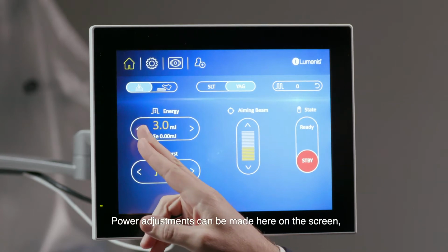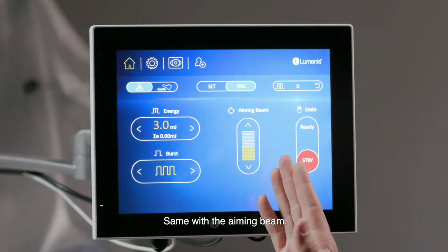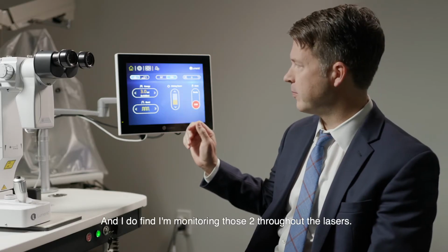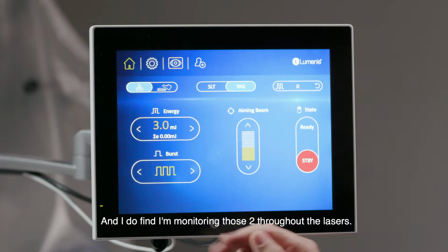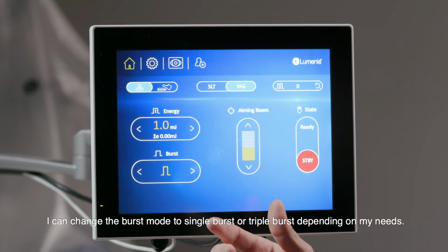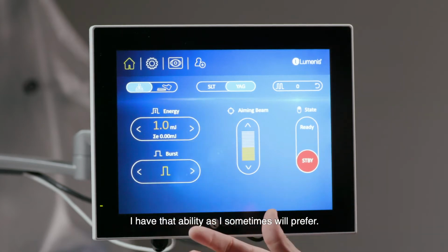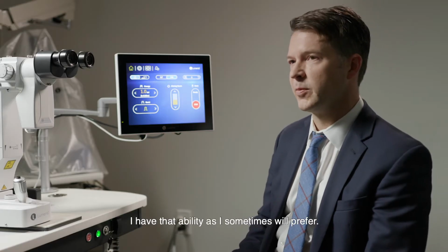Power adjustments can be made here on the screen, but also on the laser itself. Same with the aiming beam. And I do find I'm monitoring those two throughout the lasers. I can change the burst mode to a single burst or triple burst depending on my needs. And of course, if I want to use a foot switch, I have that ability, as I sometimes will prefer.